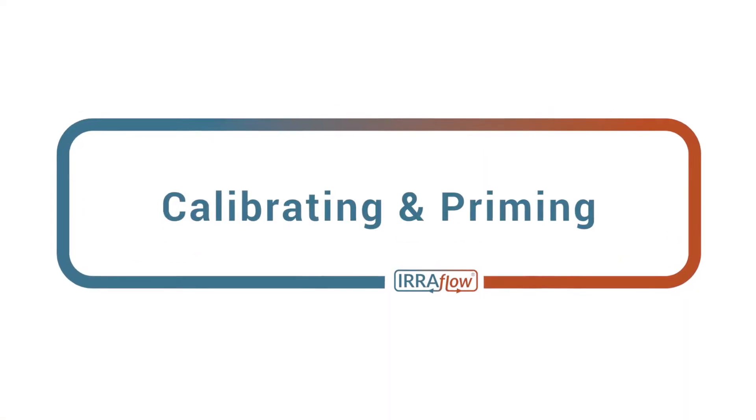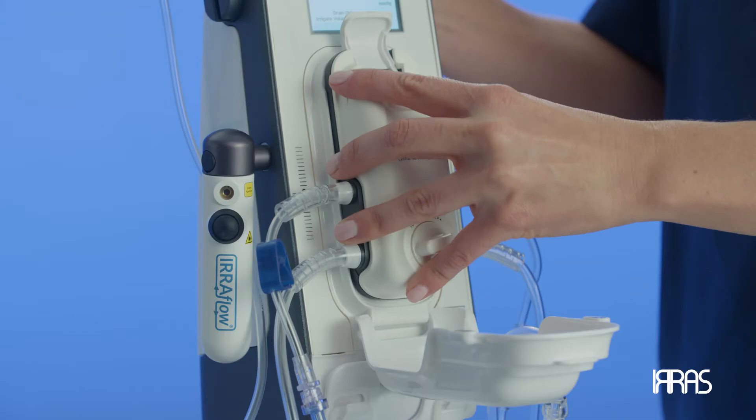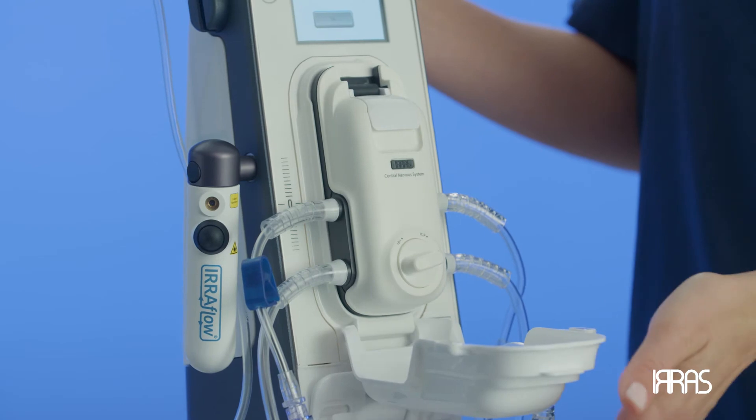Chapter 3: Calibrating and Priming. It's now time to calibrate the cassette. Calibrating the cassette ensures the transducers are reading the accurate ICP and considers the atmospheric pressure in the room.